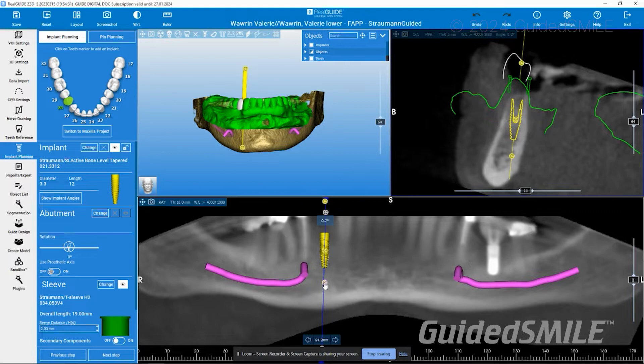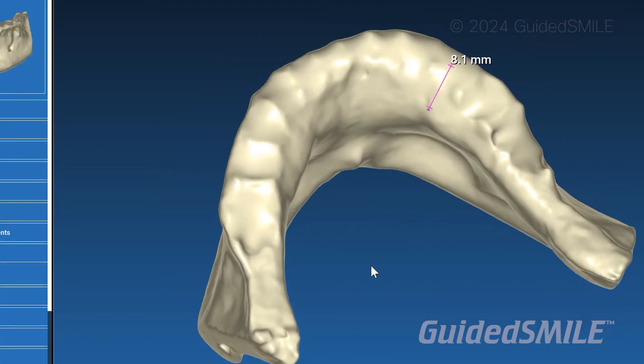If you want to go to the next level, you can upload your case to us. We'll work through a case together online where we are planning the case for you — we're moving the mouse, you're watching. It's a great way to learn.